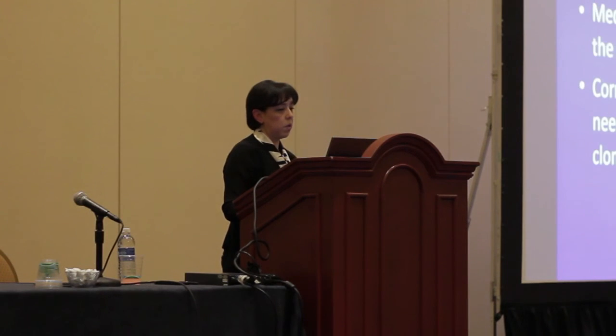And at the MRD assessment level, we actually have not established what the limit of detection is for us yet. So we have a lot of work to do in terms of the limits of detection and the MRD level. But of the samples that we have done compared to flow cytometry, we can go beyond the 1 times 10 to the minus 4 that the flow cytometry gives, because we have had cases where we actually pick up the clone beyond that on a negative study by flow cytometry.